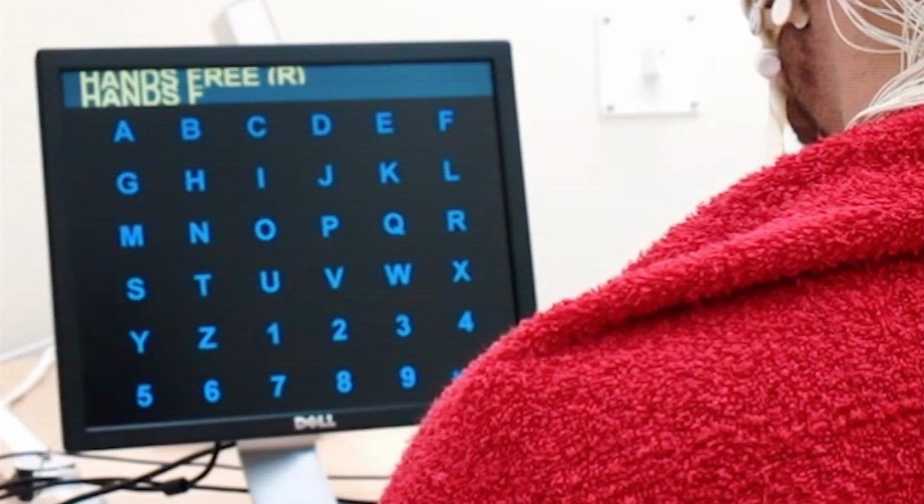Of course, highlighting unneeded commands will result in sensory responses alone, while highlighting the desired command that the patient has picked produces a P300 wave, which is detected by the classifier. Because the P300's amplitude is relatively large, from 2 to 5 highlights could be sufficient to choose the desired command. And the device starts. The chair moves in the selected direction, or the letter of choice shows up in the field.